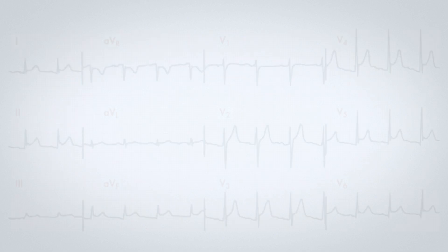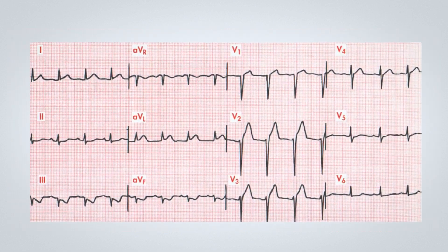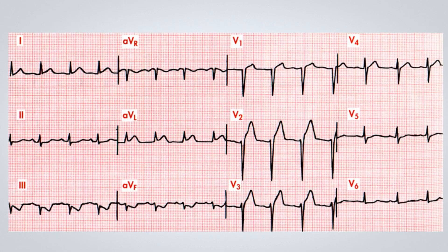Here is the first electrocardiographic tracing. I suggest pausing the video to carefully analyze the ECG. Now let's move on to the second tracing, which represents the second patient with the same chest pain symptoms, also 50 years of age. Again, I suggest pausing the video to carefully analyze the ECG.